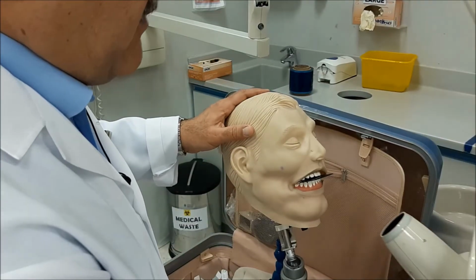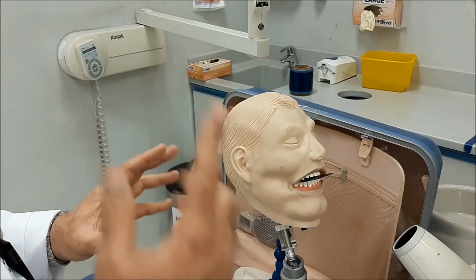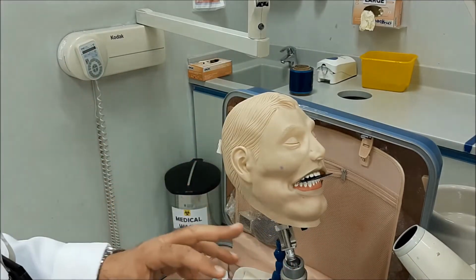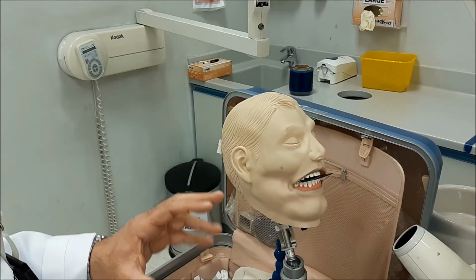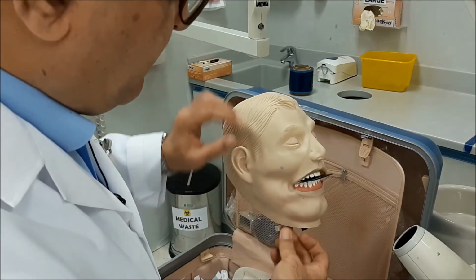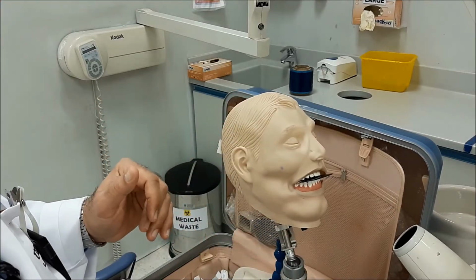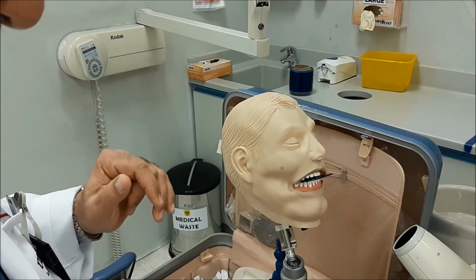Now, if you need the whole mandibular floor of the mouth or the mandibular area, then you are going to use the topographic or the 90-degree occlusal film.